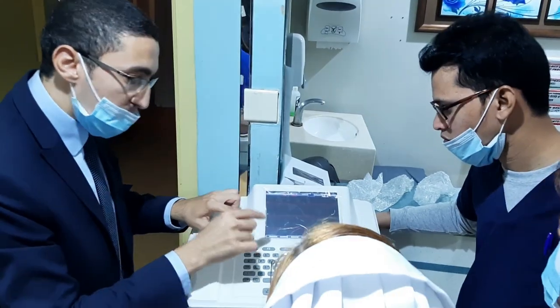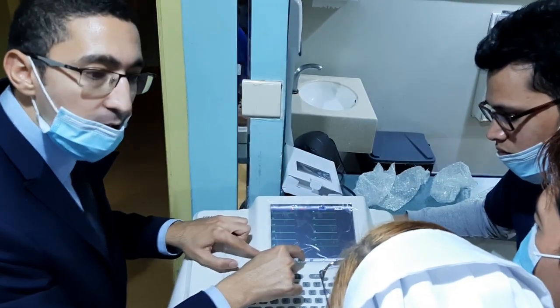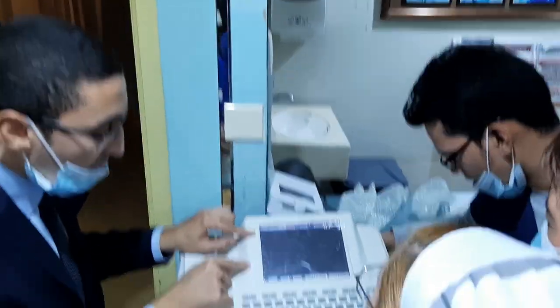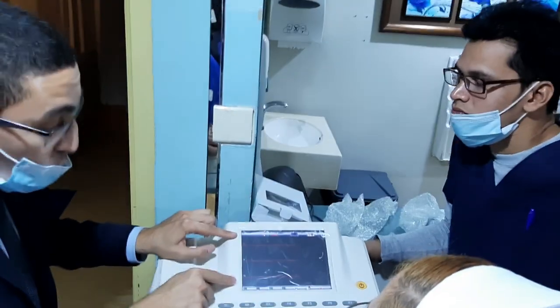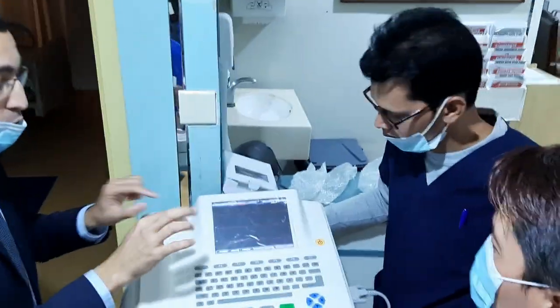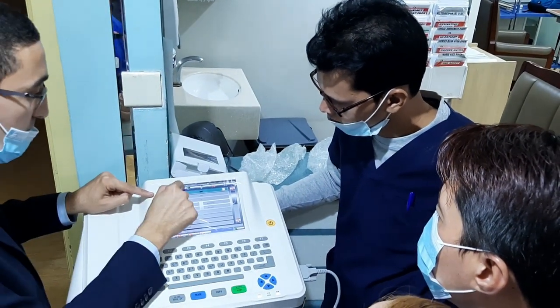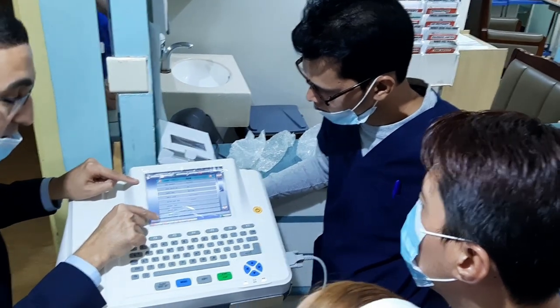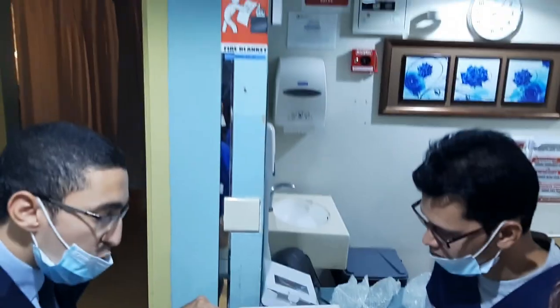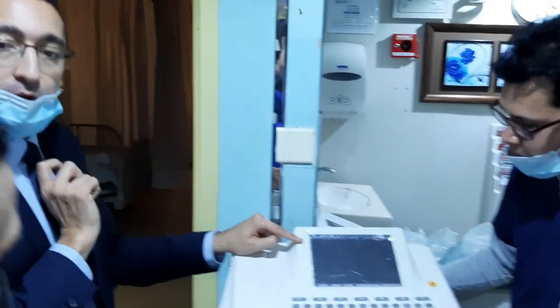Maybe you are using manual, but it's the most important auto. Resume only these three, and you can choose which one. If the doctor finds it important, three only. He will put three, and you can adjust from configuration. Then leads. You can adjust which leads, lead one or lead two. This one will appear here on the screen.